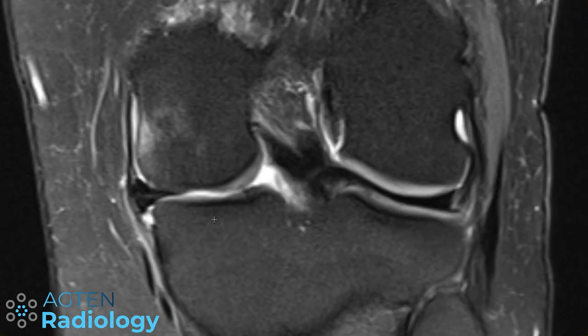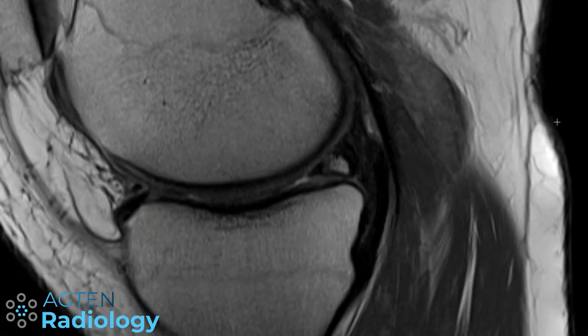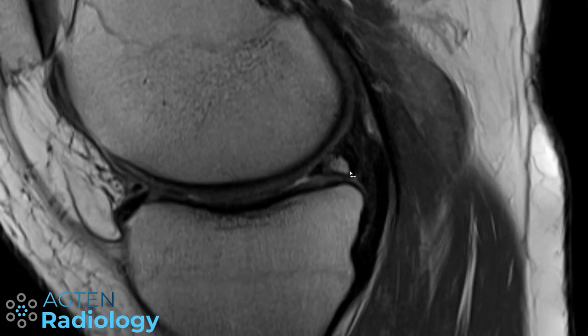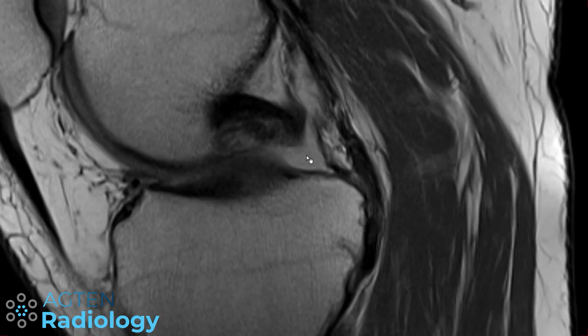So we scroll posteriorly and we can see here that there is a gap. So we don't have a root here. Let's again go back to the first sequence that we had a look at. This is proton density weighted. You can see here the fluid is hyperintense. This is the intrameniscal ossicle, so this is not a ghost sign. We come back to that later. We scroll further and we can see some remaining fibers here, but the rest of the root is completely gone. So this is a root tear of the posterior horn of the medial meniscus, or a root avulsion rather.